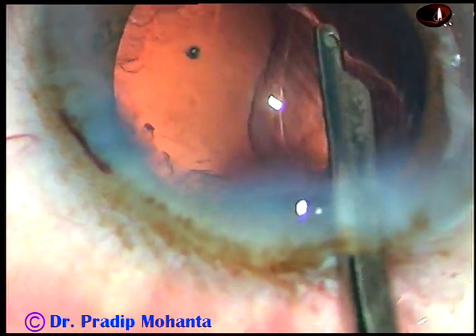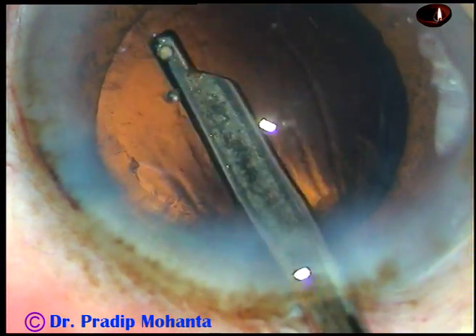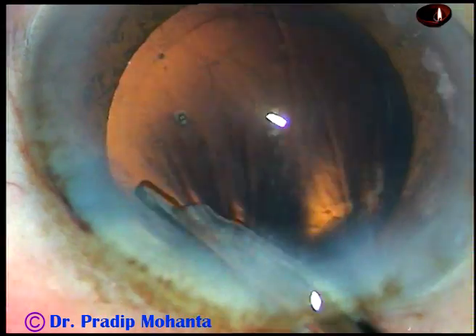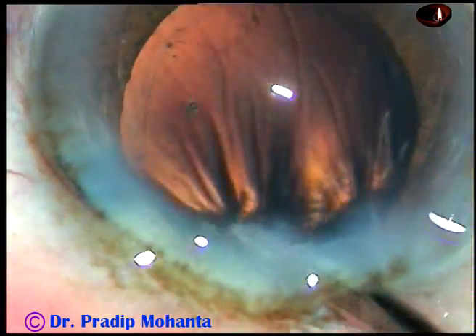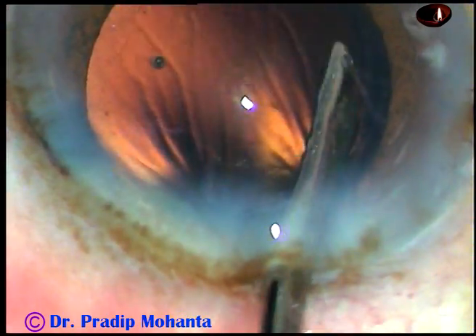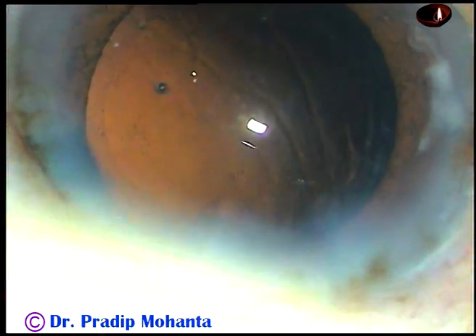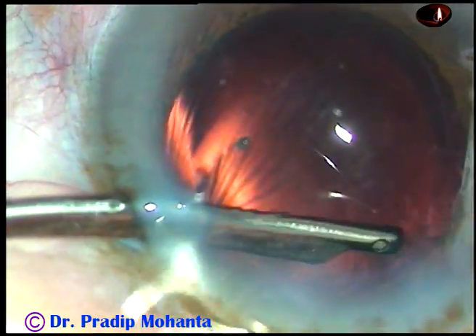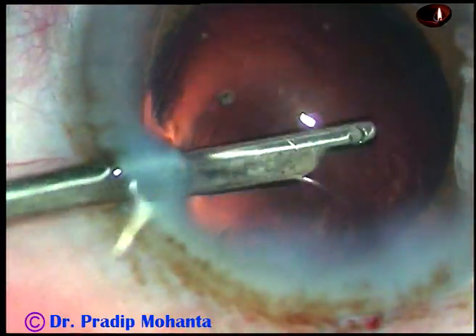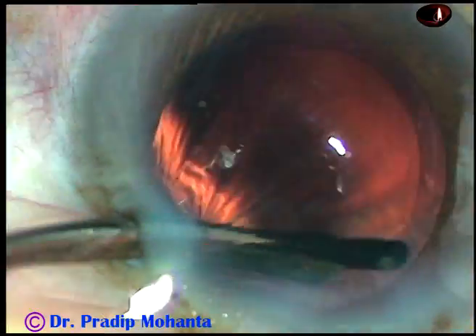And now cortical cleanup is to be done. There is very little cortex in this case because the cortex has become nucleus. However, some fibers were there and they are being removed. To remove the soft incisional cortical matter, I go through the left side port and remove it. Cortical cleanup has been done nicely.